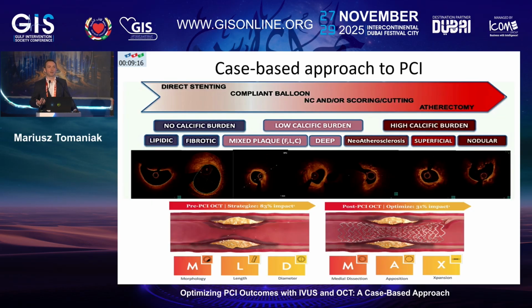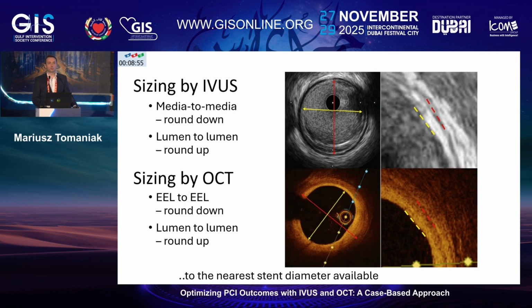But all these features we are looking at after stent placement in the coronary artery, whereas it's super crucial to perform intravascular imaging already upfront to both prepare for the angioplasty, to have a good sizing of our stent, and also to look at the plaque morphology, as nowadays, having several dedicated devices available for plaque preparation, it has true clinical implications.